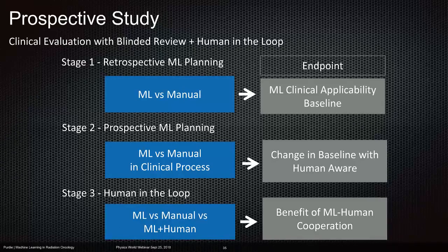And so, in fact, we have already treated 2 patients using machine learning-based plans at our center. This has been a relatively new endeavor, but we're going to start a formal prospective study where we want to take a look at how ML is impacting the process in the treatment planning. And so I'll just quickly run through 3 steps here.